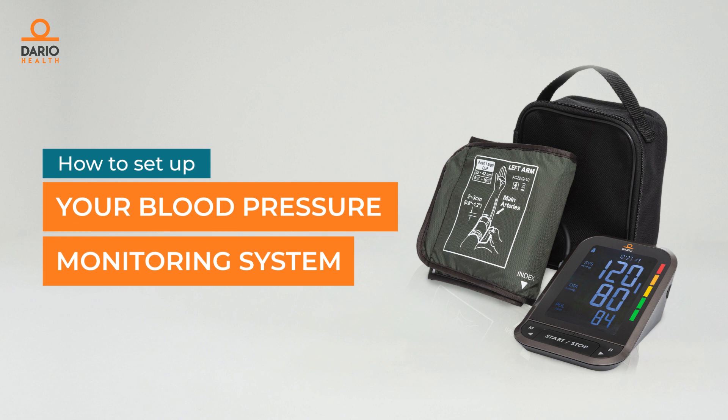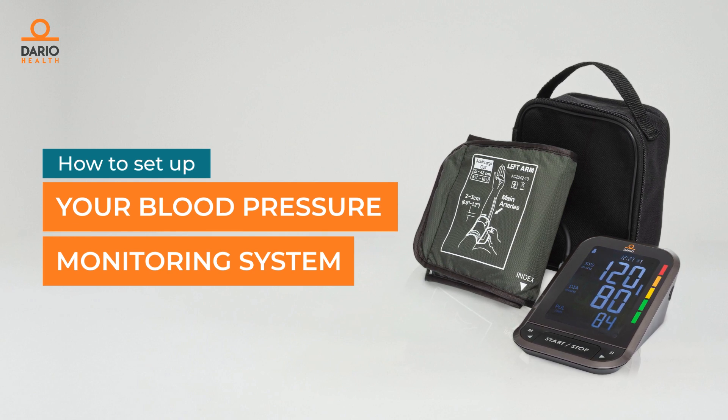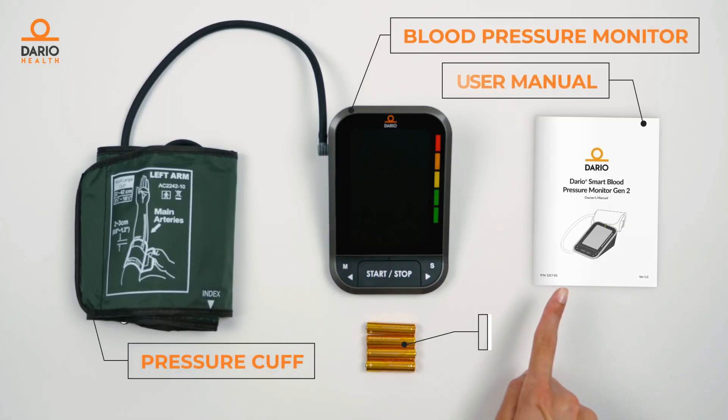Your Dario blood pressure monitoring system has everything you need to successfully monitor your blood pressure. In the box you'll find your blood pressure monitor, the pressure cuff, the user manual and batteries.